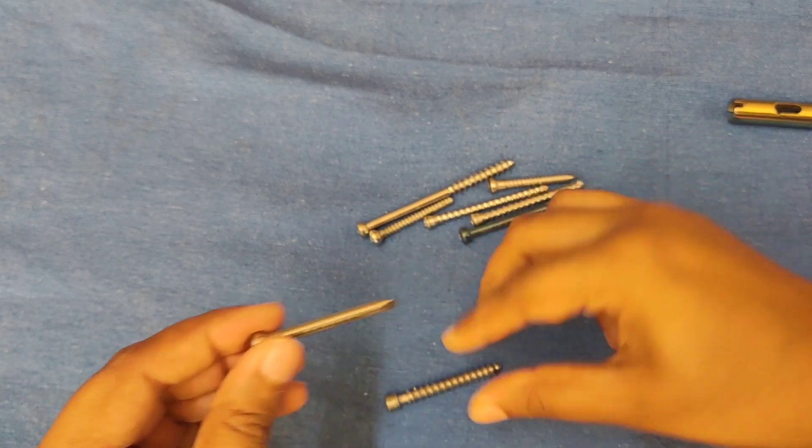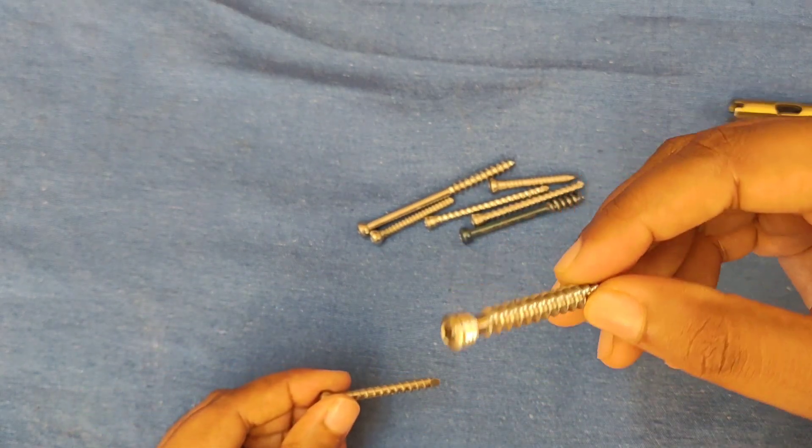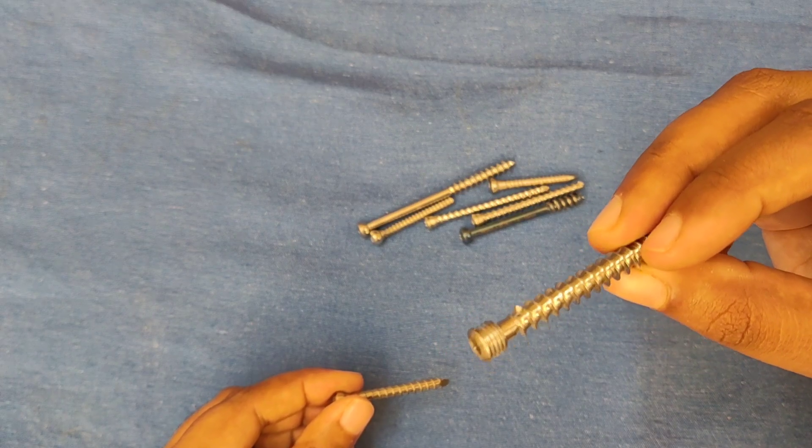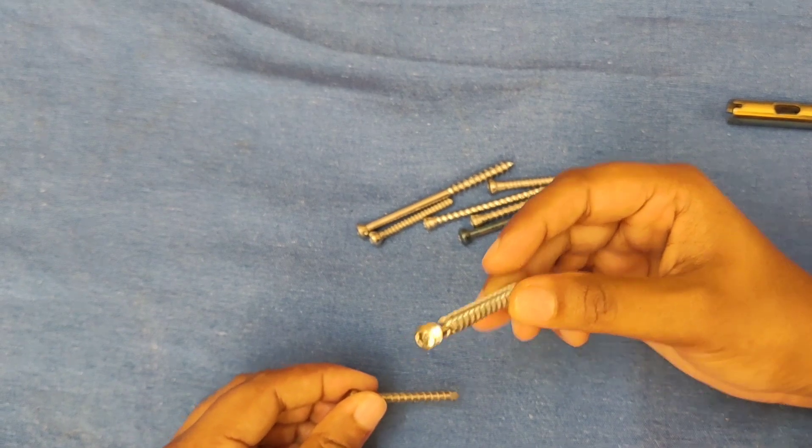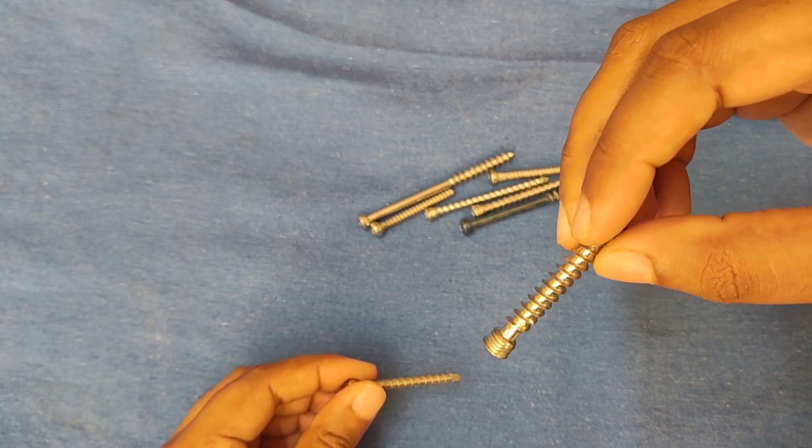In case of cancellous screw, it has a larger thread diameter and smaller core diameter. The tip is corkscrew and it has cutting flutes at the tip.